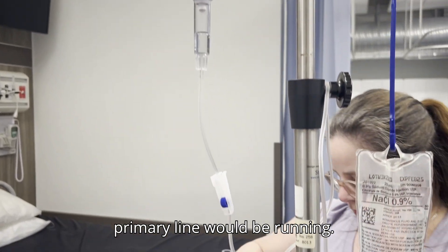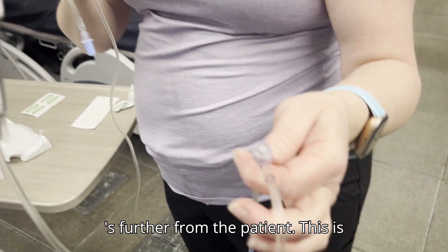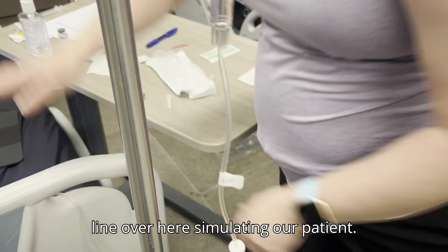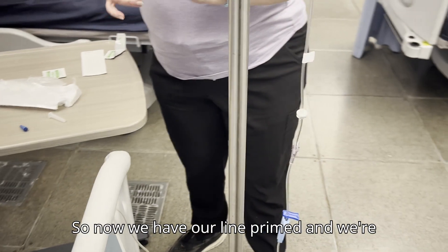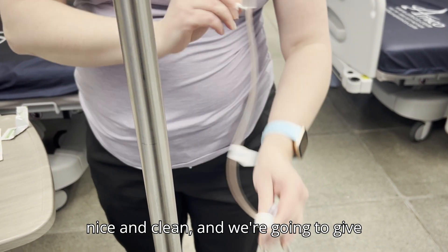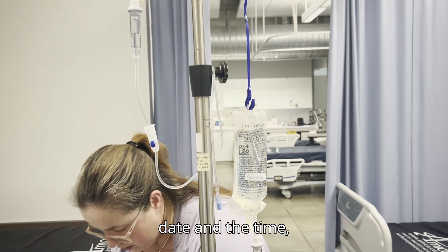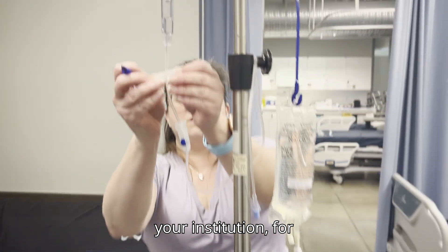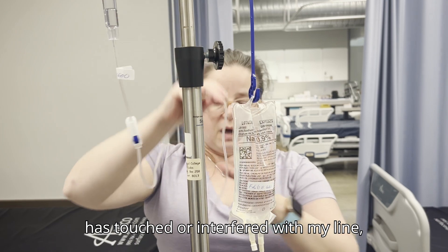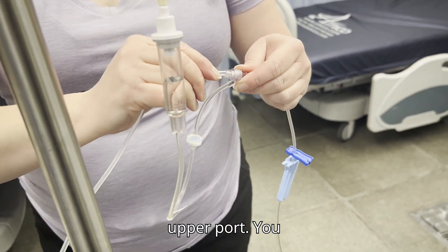Our primary line would be running, and you always attach your secondary line to the upper port — the one further from the patient, not the one closer to the patient. I'll simulate our patient line here. Now with the line primed, we clean the upper port, give it a moment to dry, and while it dries we label this secondary line with the date and time — good for 24 hours depending on your institution.